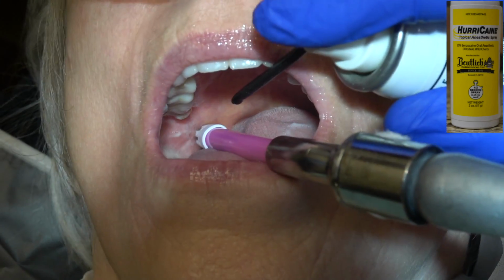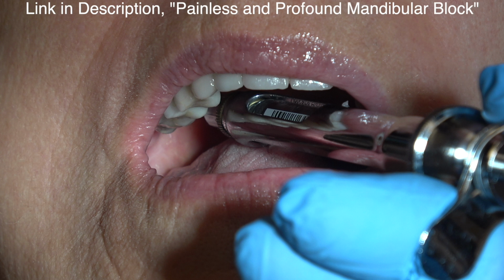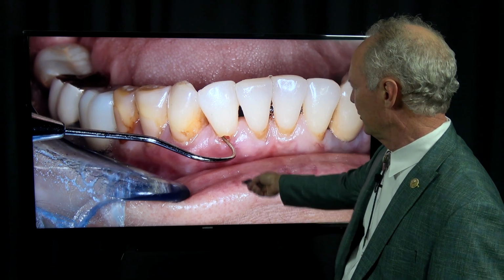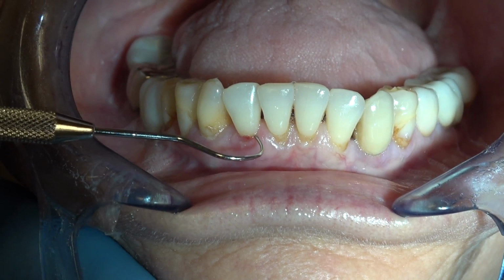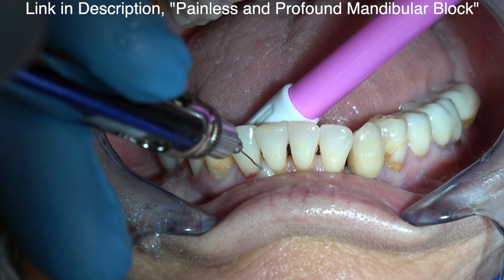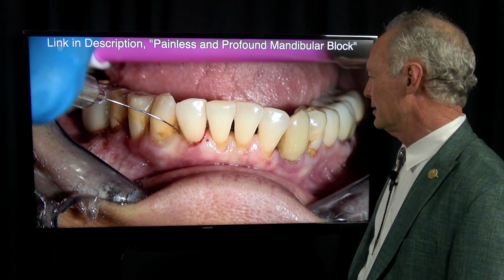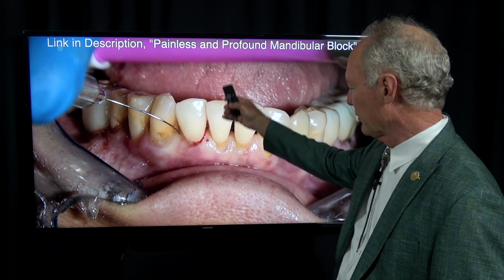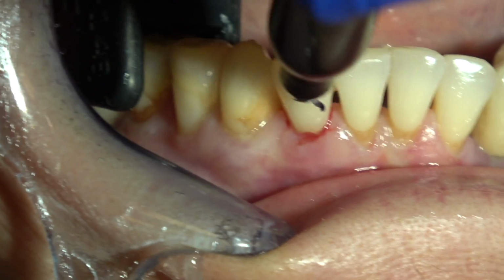You can see again the internal resorption. Very important to administer painless and profound local anesthesia. You can watch the videos on mandibular and maxillary painless and profound local anesthesia. So you can see here's the internal resorption. Just like a beaver cutting through a log, it's just worked its way almost all the way through the neck of that tooth. So I'm administering intraligamental local anesthesia, and this is with Citanest 4% plain in a 30 gauge needle, and you turn the bevel toward the tooth in the sulcus and apply pressure for about 20 seconds.